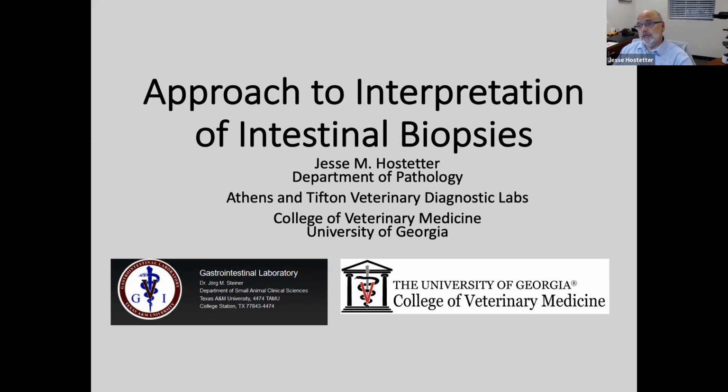Today I'm going to talk a little bit about an approach to interpretation of GI biopsies. I've given this lecture a few times, and I always start the same way, by saying that I really don't intend to represent myself as an expert in this area. In fact, some of you may have more experience than I do reading these biopsies.